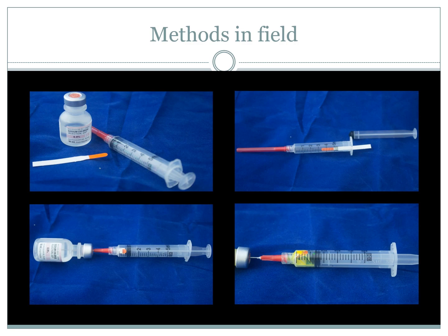Now, the idea of the strips can seem a little bit daunting because the recommended use is you dip the end of it in a little bit of normal saline, and then you physically place it into the lower part of the eye, in between the eyelid and the eye itself, for the Fluorescein to absorb into the tear film. Okay, so not the best and quite uncomfortable for the patient as well.